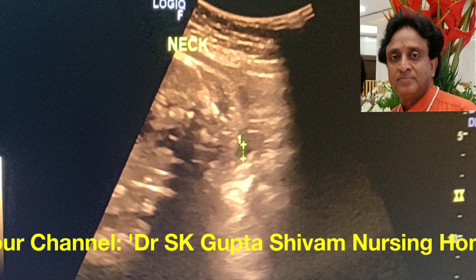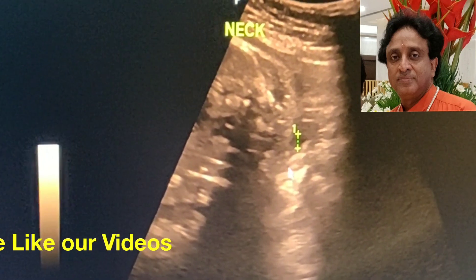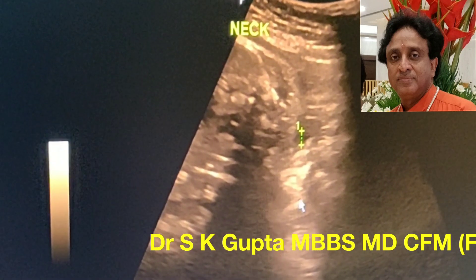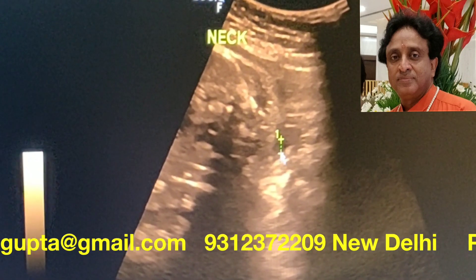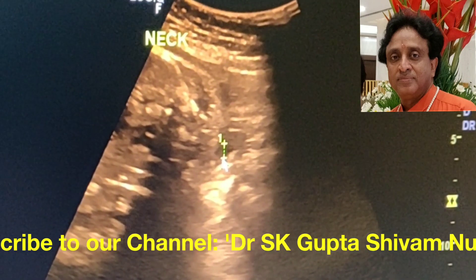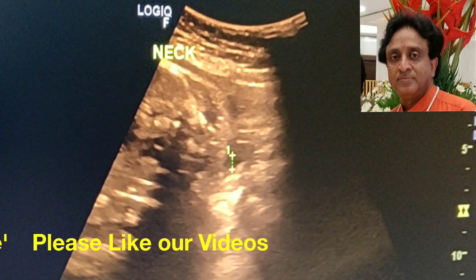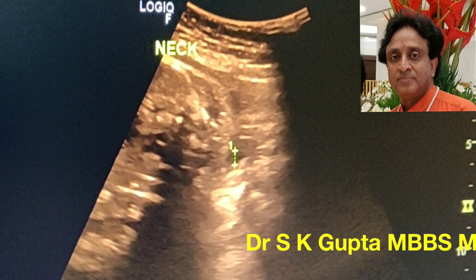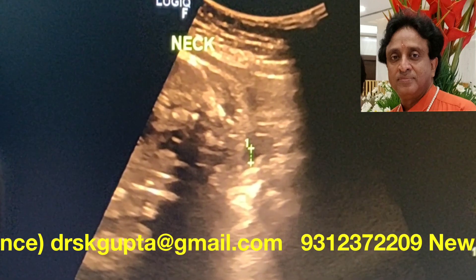Whenever you are not able to find amniotic fluid around the fetus, you should always try to look for fluid around the neck because amniotic fluid is generally maximum there. Here you can see the head of the baby, the body, and the neck. Around the neck, the fluid depth is not more than 0.6 centimeters. When we measured the amniotic fluid in all quarters, the total AFI was not more than 4.5 centimeters, confirming oligohydramnios.